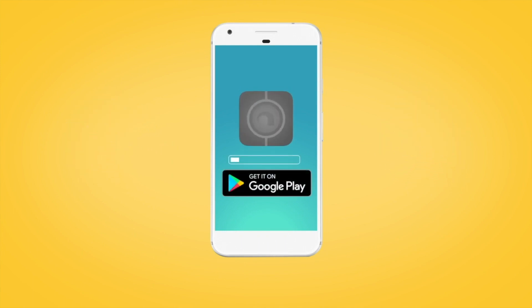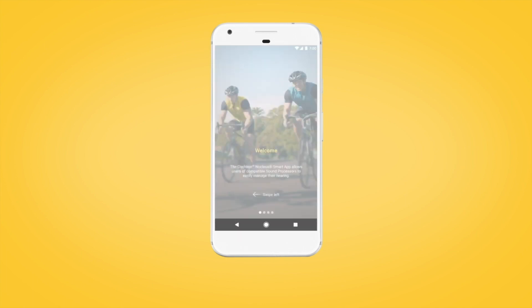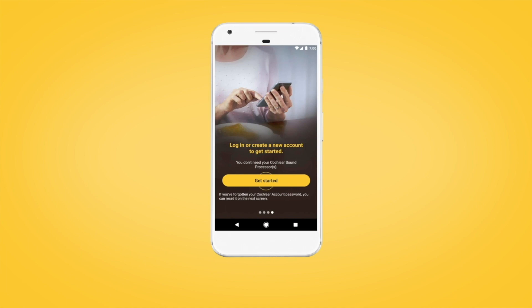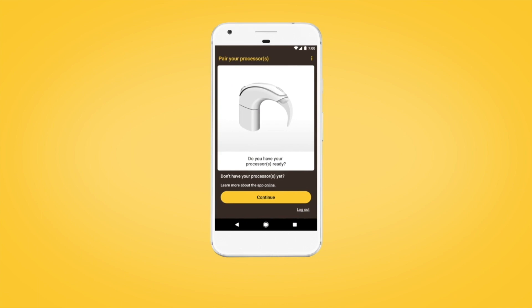If you have not done so already, download the Nucleus Smart App from the Google Play Store. Open the Nucleus Smart App and swipe through the welcome screens. When prompted, create your Cochlear account or log in if you already have an account.